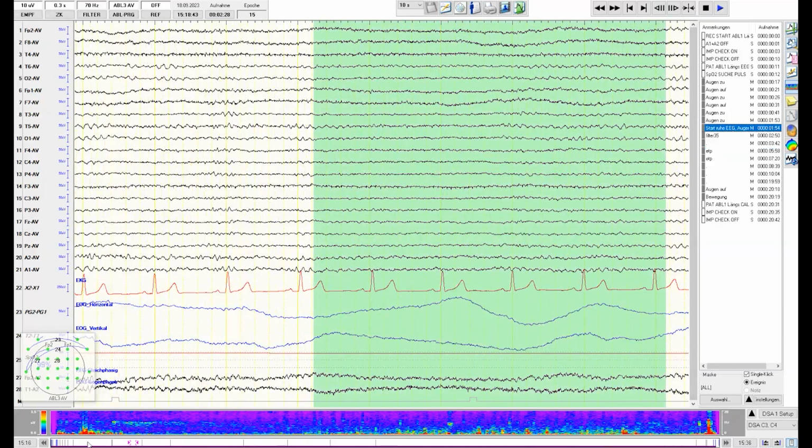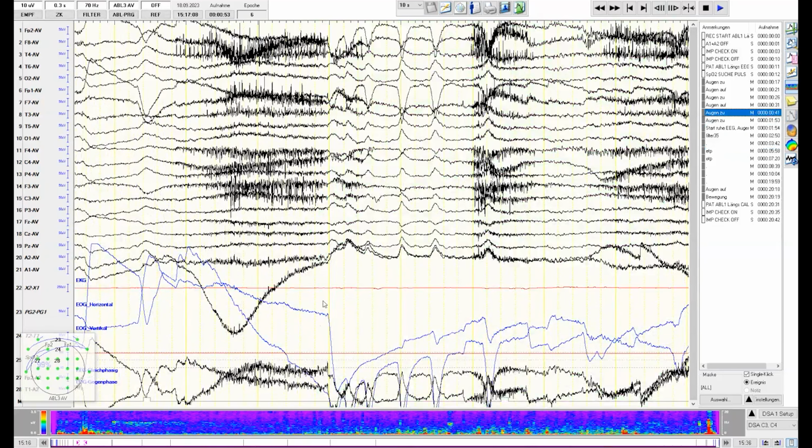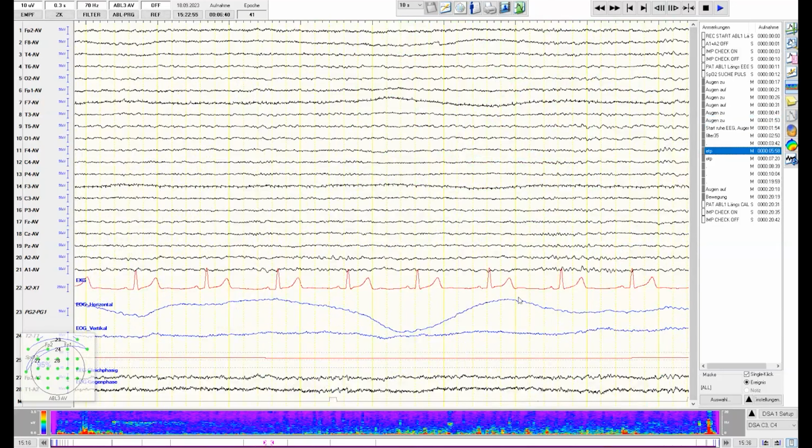So if you look, maybe we go to the beginning, here you see a normal EEG, someone has saccades looking around. But if you have slow and smooth, like here, slow and smooth over several hundred microvolts, the patient clearly is tired. And I think this is very important because if you have someone who says, I didn't sleep the last 5 nights, I had no sleep at all, but in the EEG and EOG, there's a very straight line and no signs of drowsiness, then either he doesn't need sleep or he slept well. So this is something you can try to validate: what the patient tells you and what the recording tells you.